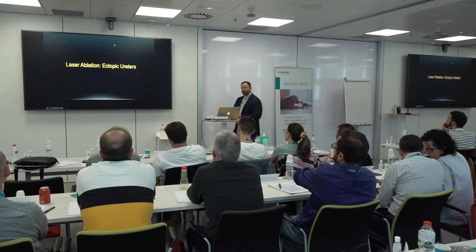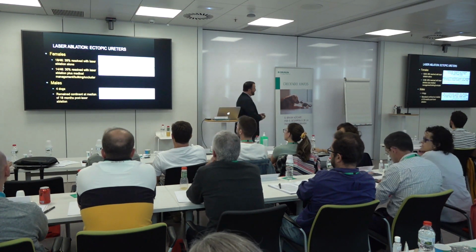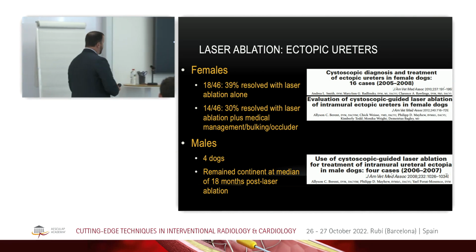All right. Let's talk about ectopic ureter ablation then. So there has been some evidence behind this, so it's been looked at. So what we're talking about here is these intramural ectopic ureters. So we actually see a decent amount of these.